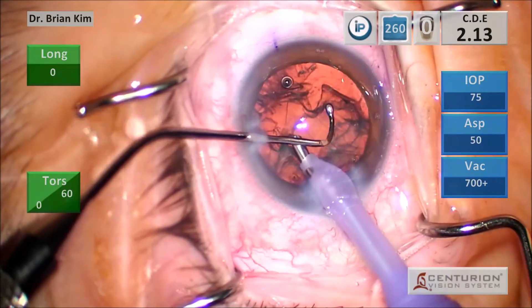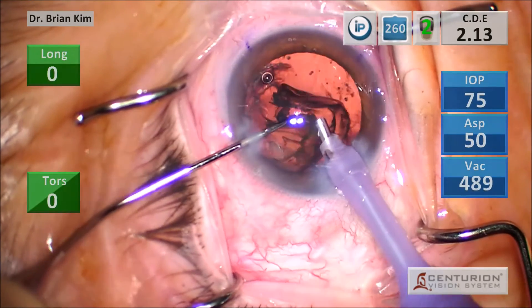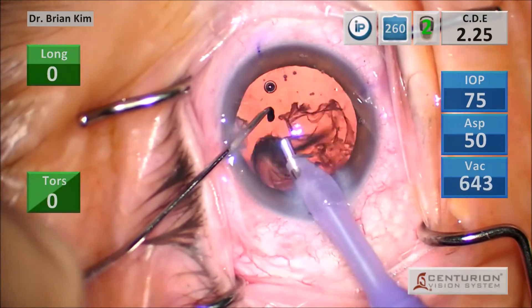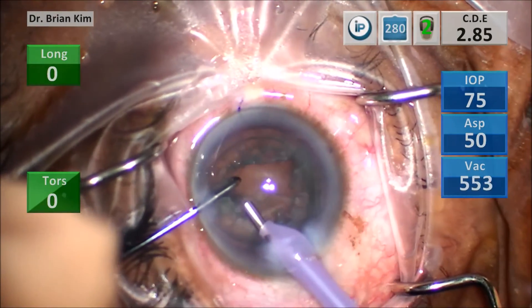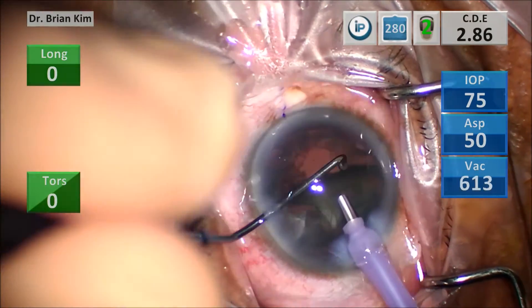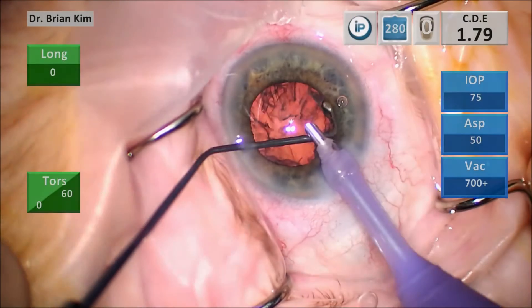These examples show removing epinucleus safely. I use the chopper to go under the anterior capsule and above the epinucleus, teasing it centrally. As I do that, I lift it and grab the edge with the phaco tip. Mobilizing it causes fluid to dissect between the epinucleus and the posterior capsule, allowing easy removal. Here with a thick epinucleus shell, I get my chopper around it to create space between the epinucleus and posterior capsule.